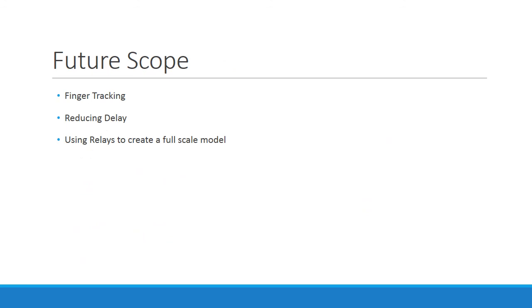These are the possible areas of development in our project. Our initial aim was to control the wheelchair by using a single finger through finger tracking. This can be achieved only by color tracking rather than object tracking. If this is implemented, this could be a boost to people who are older, as it would be difficult for them to remember the correct number of fingers that should be shown for movement in the appropriate direction.